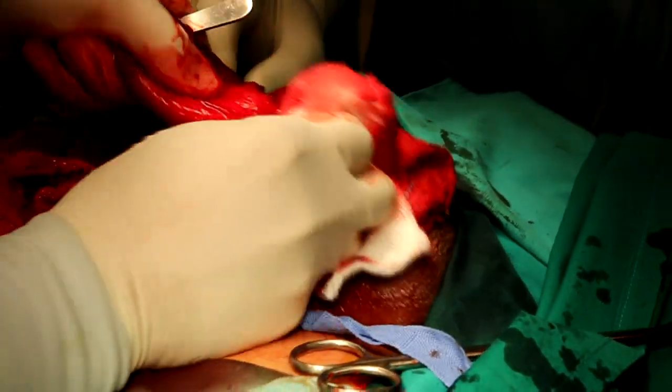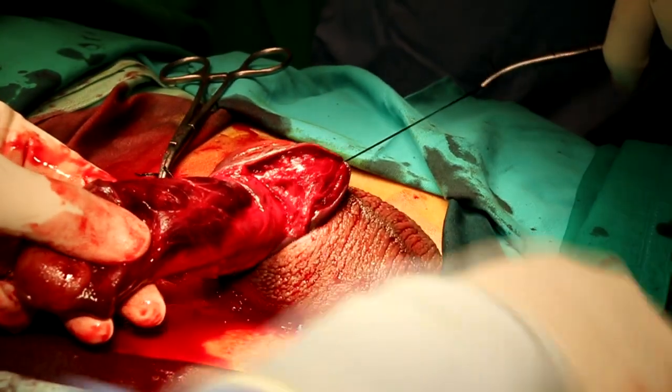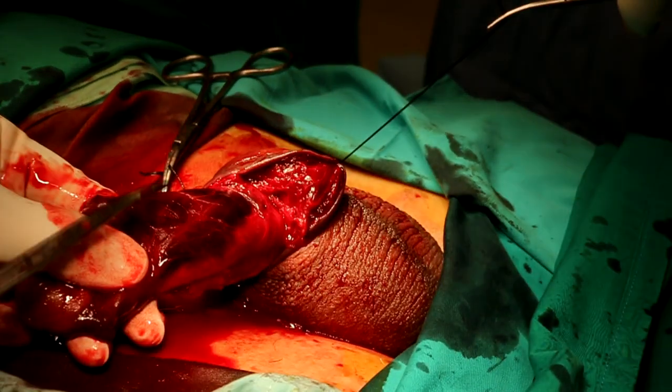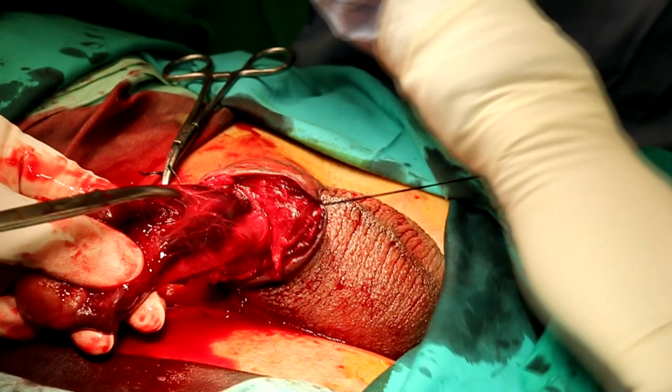See, I'm doing the gloving completely now. Okay, evacuation of hematoma. This is a very important step. You will never see the tear unless you evacuate the hematoma completely. And you see the hematoma spreads in all the facial planes now.